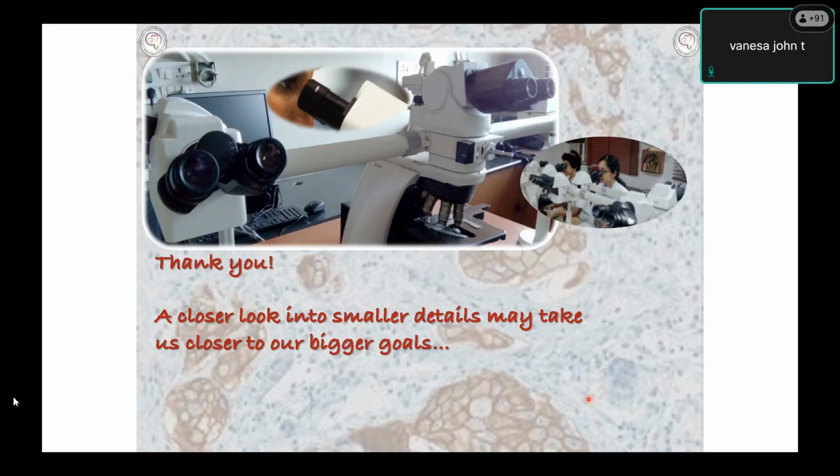Another question is, in a biopsy removed as a diminutive polyp, sometimes you don't see any abnormality. What do you report it as then? This is a common thing, madam. Look very carefully. In a diminutive polyp, look very carefully if there is a lymphoid aggregate that is causing that polypoidal thing, or if you are seeing, say in the duodenum, a little bit of Brunner's gland hyperplasia. So first be mindful of what are the small things that could cause this diminutive polyp. Sometimes it's just edema that is causing the polyp.